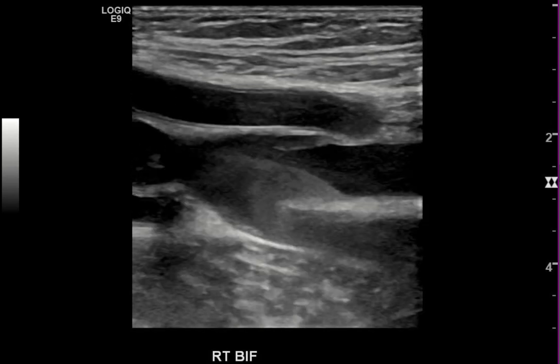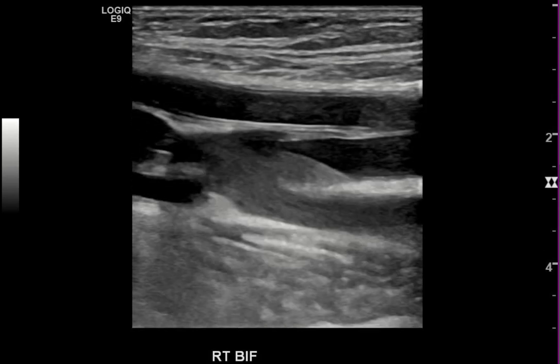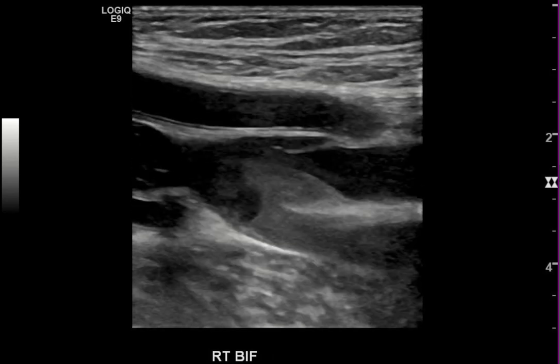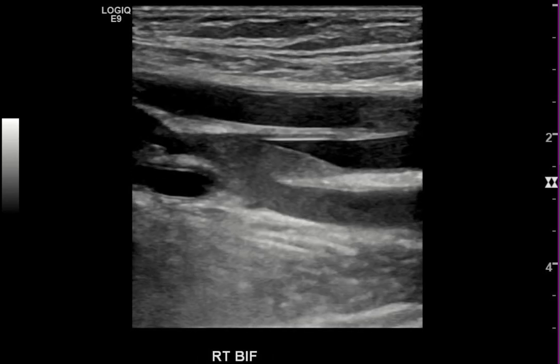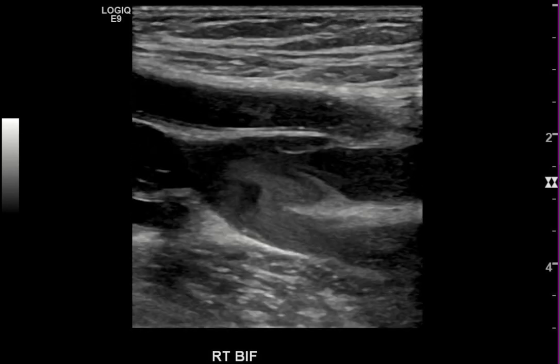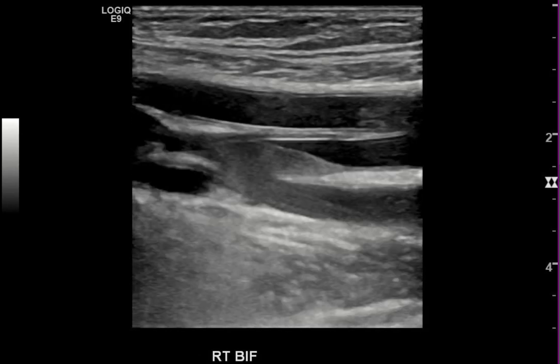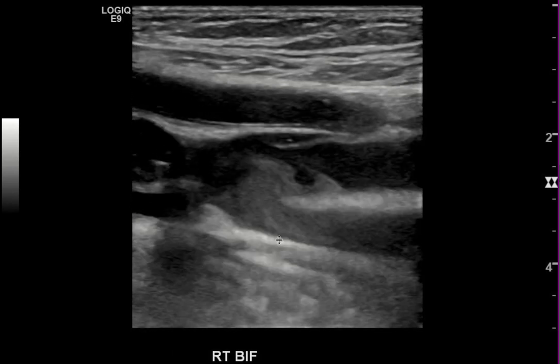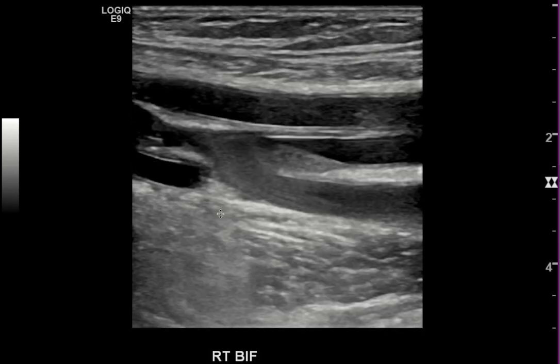Let's look at this ultrasound finding seen on a DVT study in the femoral bifurcation. In this particular case, you can see these mobile, faint, echogenic material kind of swirling with respiration or gentle compression that often settles in the dependent portion of the vein here. Here you can see the femoral bifurcation.